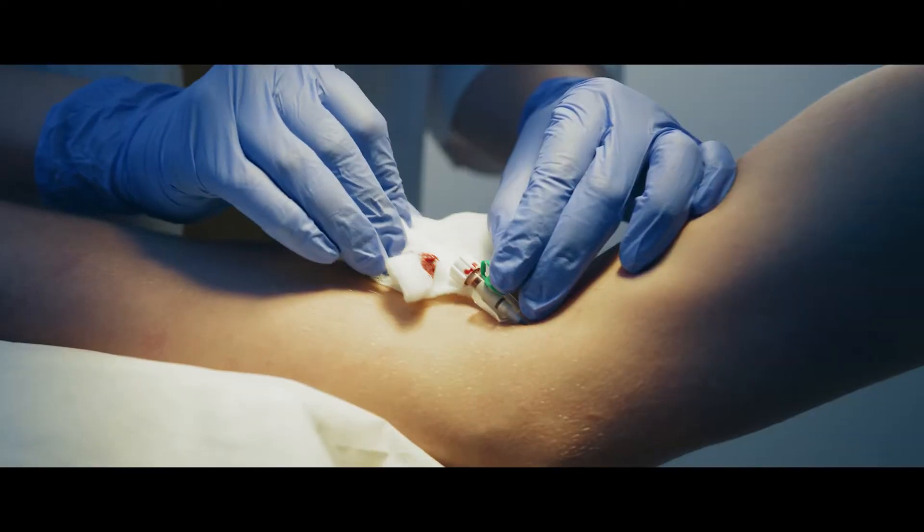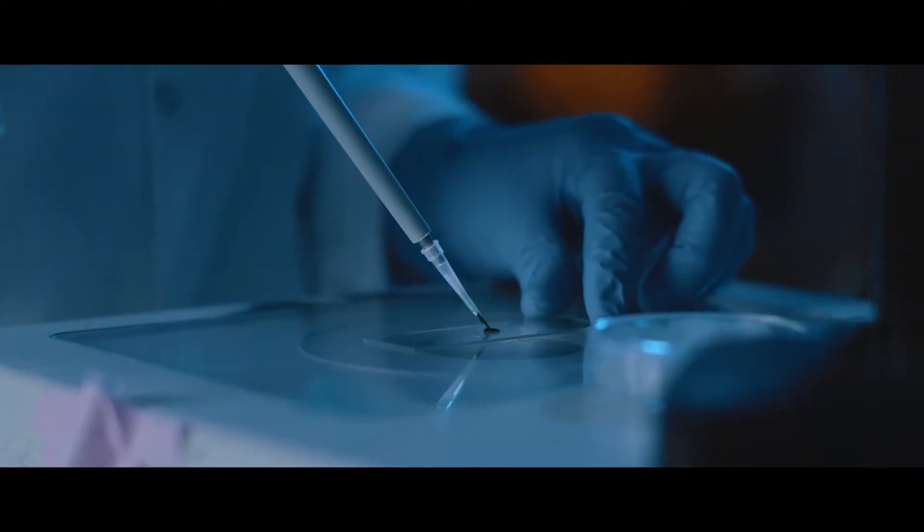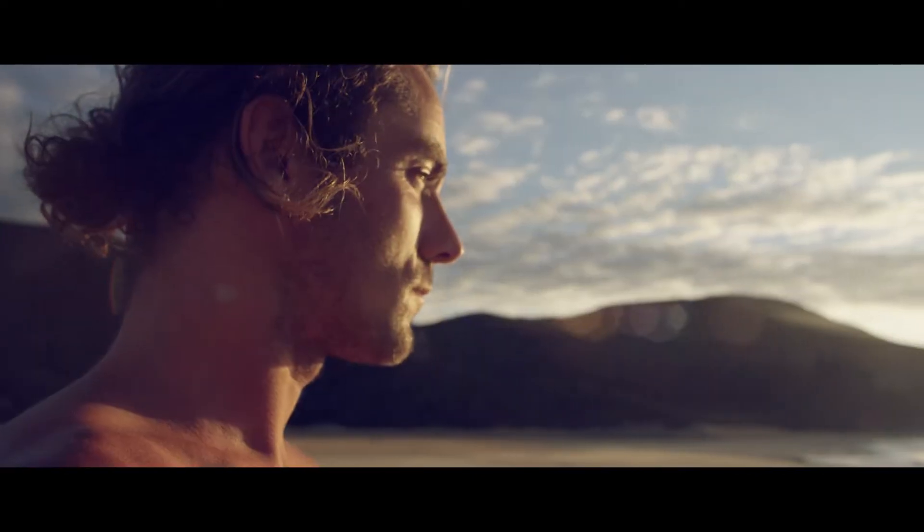Blood testing is the basis for most of the medical decisions made. A primary tool used worldwide. Hematology diagnostics is more important than ever.